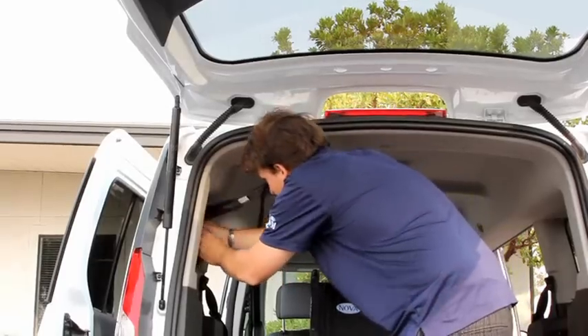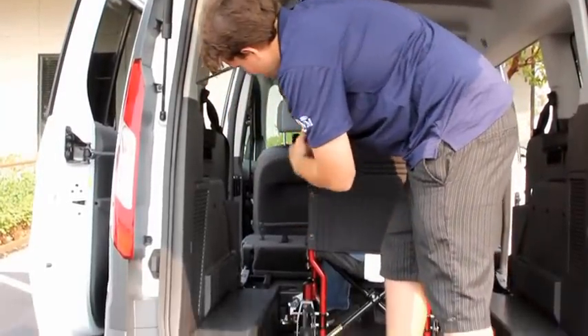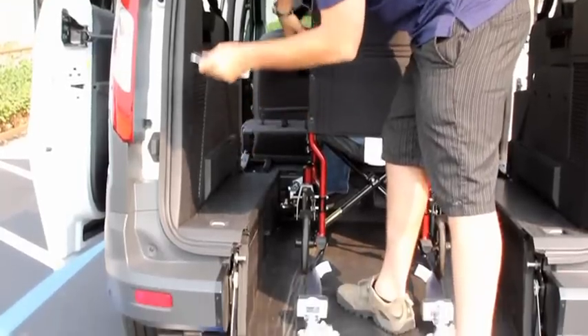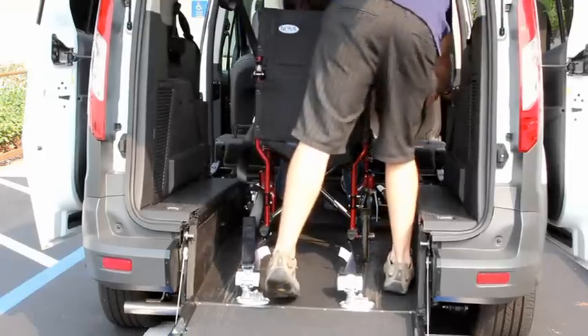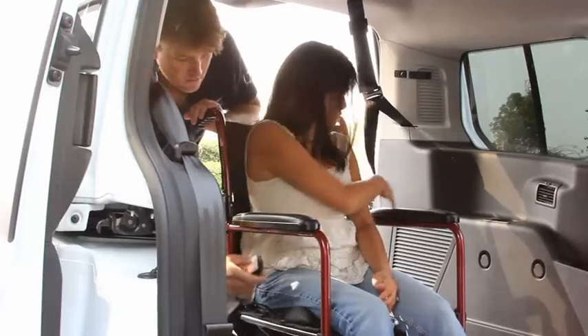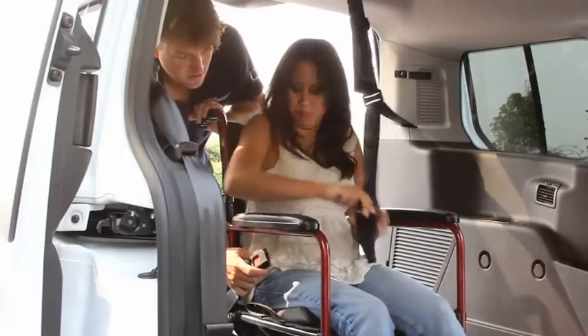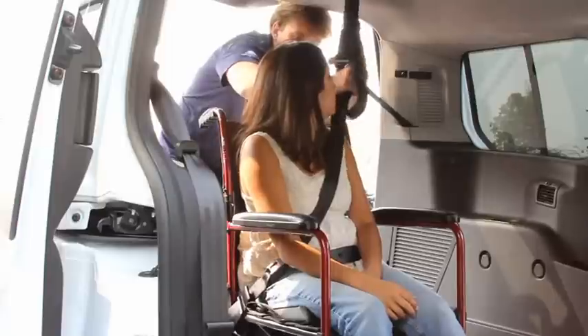Remove the shoulder belt from its stowed position. Feed the belt through the driver's side wheelchair armrest and secure the shoulder belt to the floor tie-down. Grab the lap belt and attach it to the rear passenger side tie-down. Connect the shoulder belt to the lap belt.